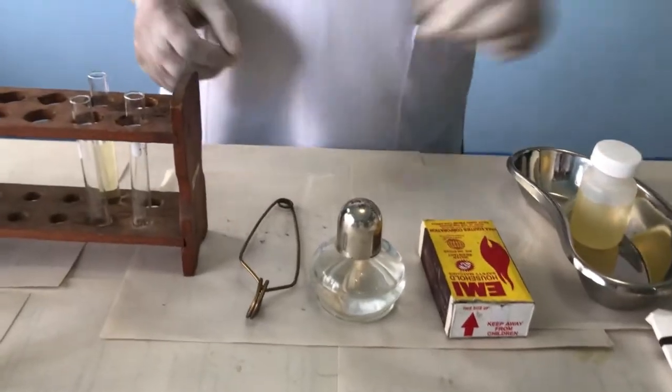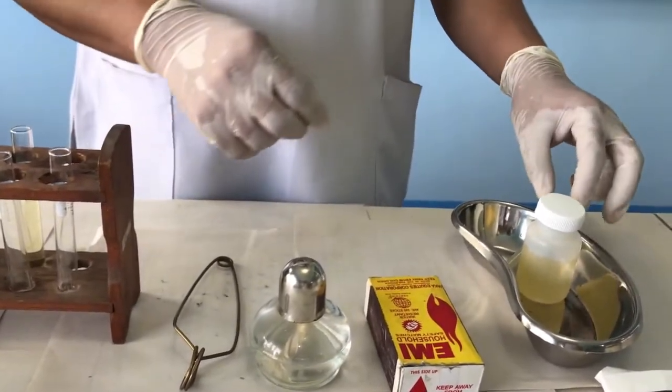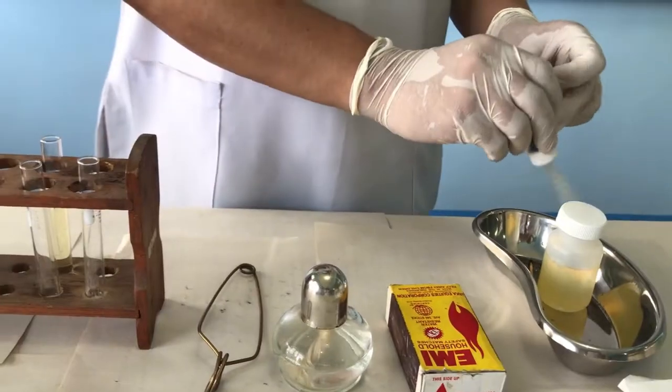Procedure: Fill the test tube above two-thirds full with urine specimen.